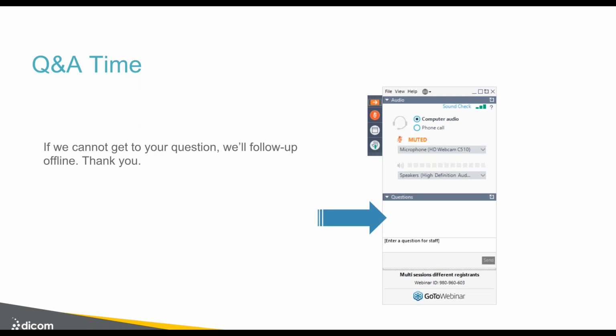Before we begin a project like this, it's important that we understand the full cross-section of the images that are intended to be de-identified. If we run into non-standard DICOM tags, we need to identify that before we start the de-identification process. Like I said, if you were trying to do this in a cookie-cutter way, we would miss those third-party non-standard DICOM tags. But there needs to be a very thorough discovery process up front, and we request samples of all the images before we get started on the project.